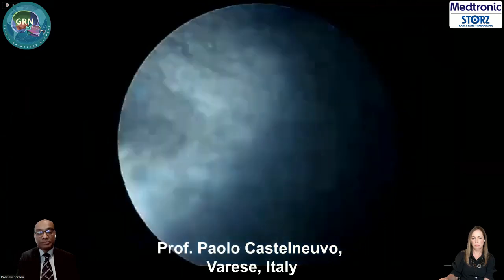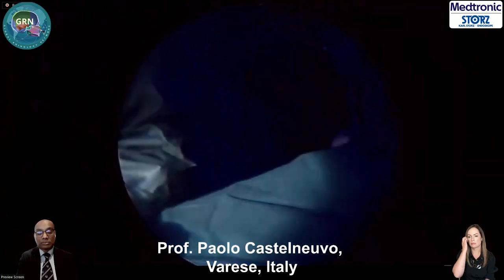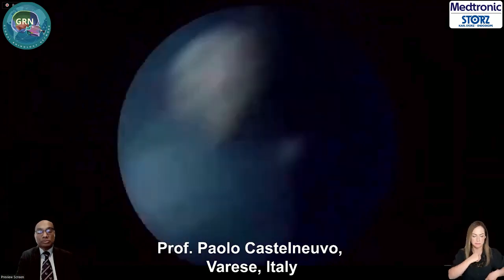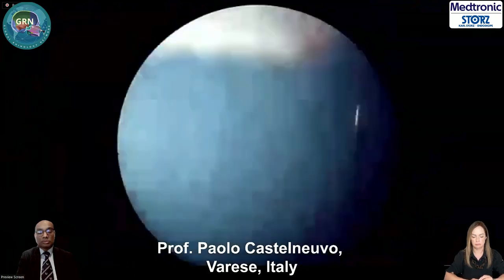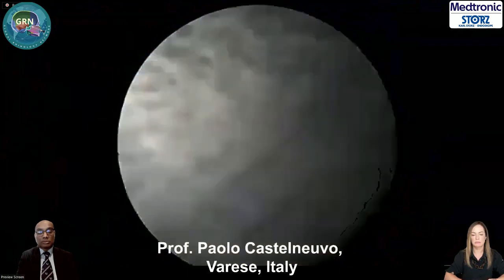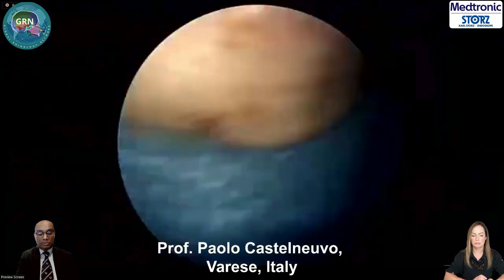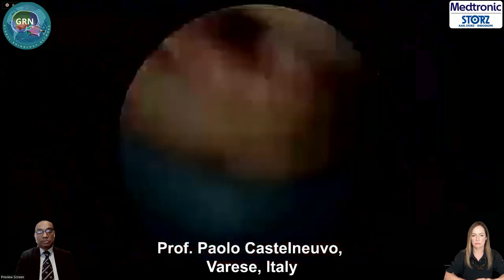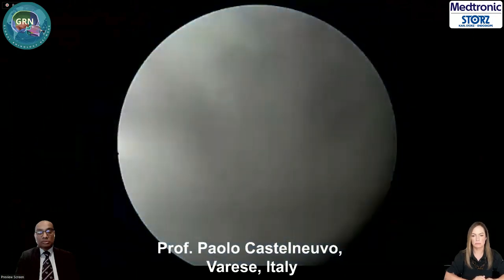Of course, the best indication for the prelacrimal approach is when the origin of the tumor, the pedicle, is not in the anterior wall of the maxillary sinus. So this case was a little bit on the border. But of course, with the prelacrimal approach, the wellness of the patient will be really different in the future years.